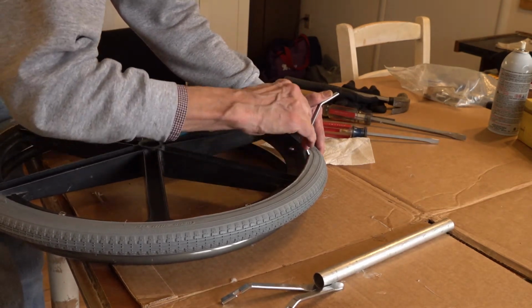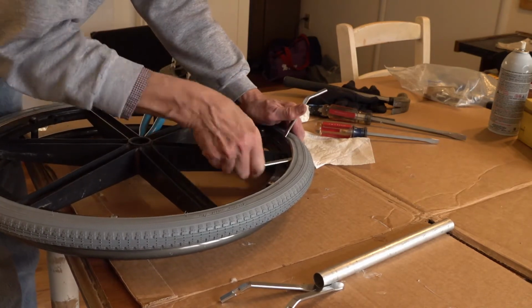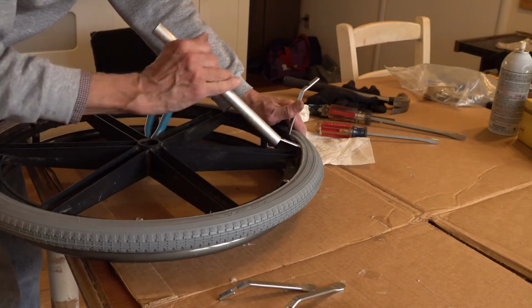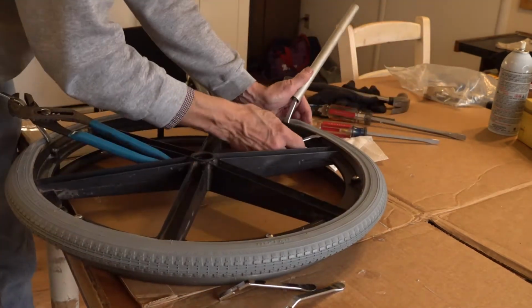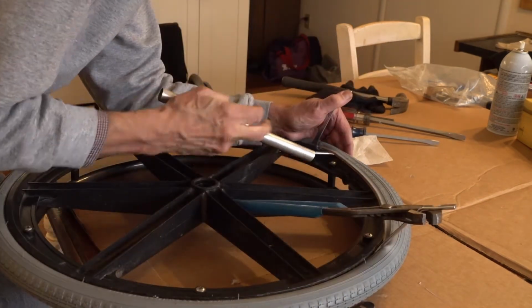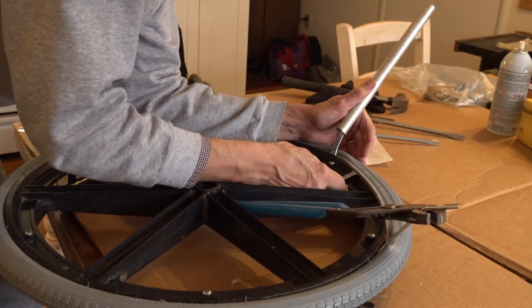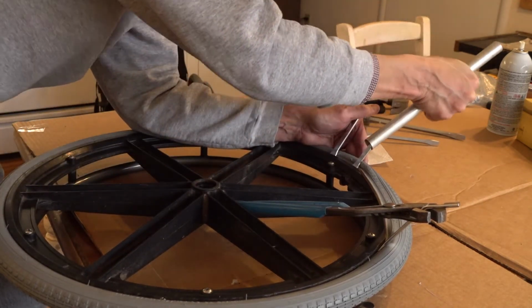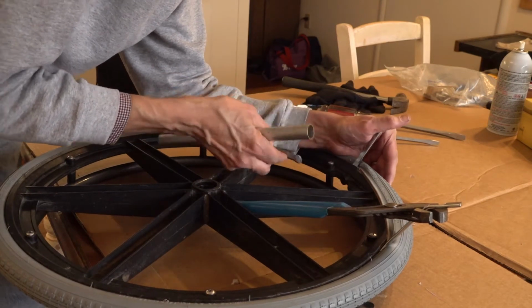Put it in, slide it toward it as far as I can, and then just flip it in, take the other one out. The further along you get, the harder it gets, so for that I have a cheater bar. I have to lean on the wheel so it doesn't flip up. Sometimes I have to get to the very final end of it. I get it, put it on the floor, and kneel on it as I'm putting on the last bit.